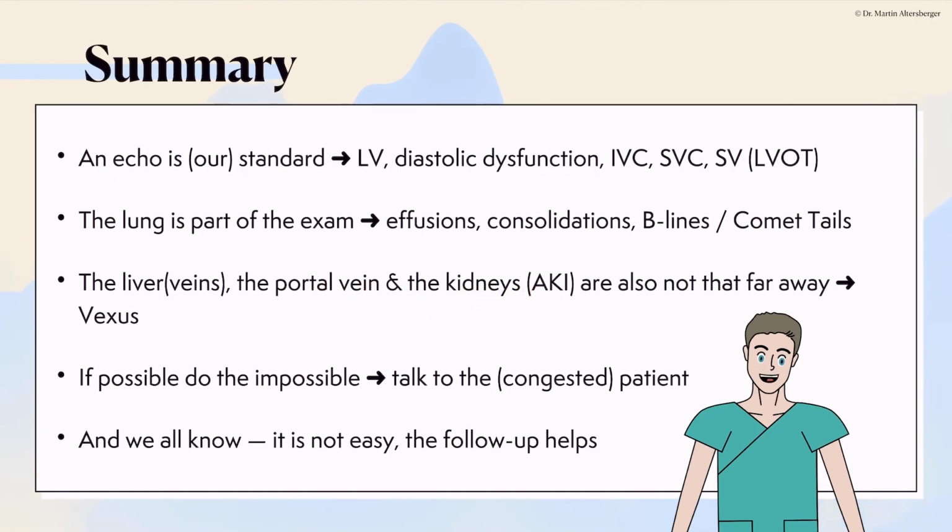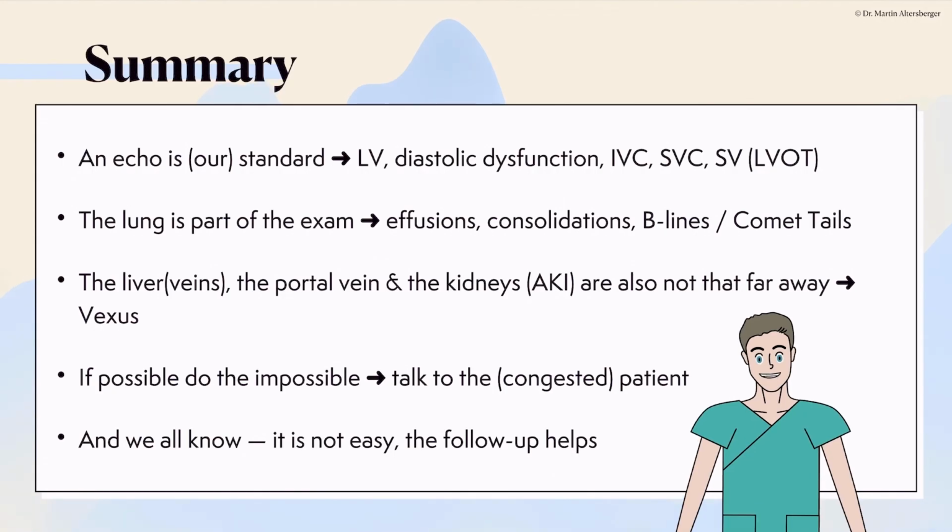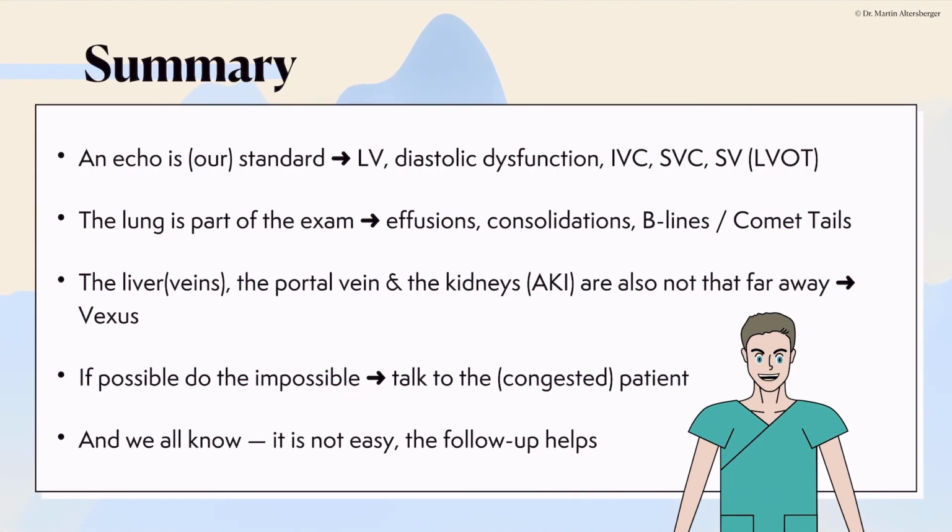And if you're used to the VExUS exam, especially if you scan your patient from time to time, you get a better idea if the problem is congestion or if the patient really is hypovolemic. But again, it's not always easy, it's not always a straightforward answer.